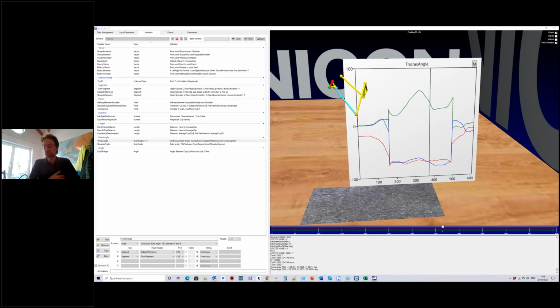I'm not really aware of using left-hand coordinate systems in bodybuilder. I'm sure you can also use right-hand coordinate systems in bodybuilder. For sure, email support@prophysics.ch with some more details, and we'll pick it up and have a look. That's absolutely fine.